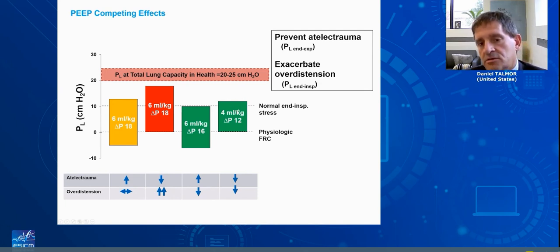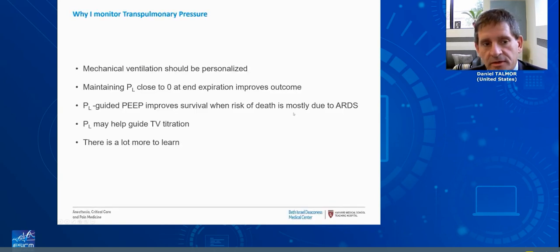And I do agree with the concepts that Luciano has advanced, that respiratory rate also plays a large portion here, and looking at limiting that to avoid the cyclic injury.